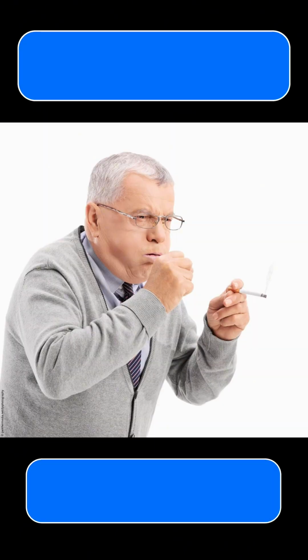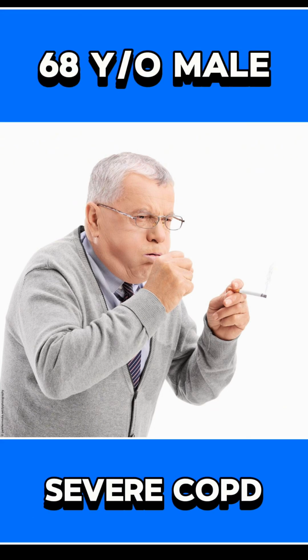All right, let's finish this up with a few cases. So, first patient, let's say, is a 68-year-old with severe COPD. They're wheezing, speaking 1 to 2 word sentences, and their end-tidal is showing 60. The waveform has that classic shark fin appearance. What is that trying to tell you? Well, it is severe bronchospasm with inadequate exhalation. You're going to give them some bronchodilators, and that should gradually return that waveform towards a square shape.